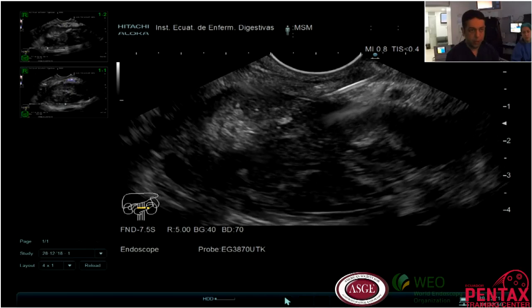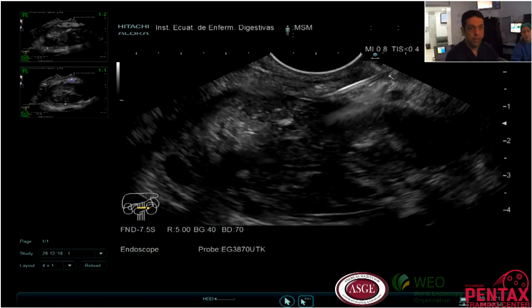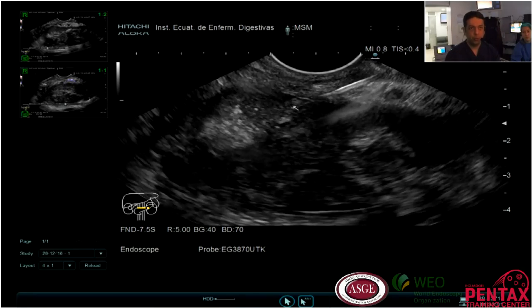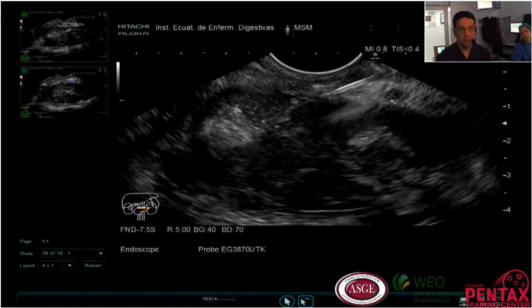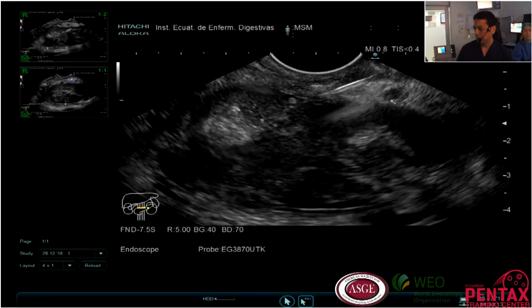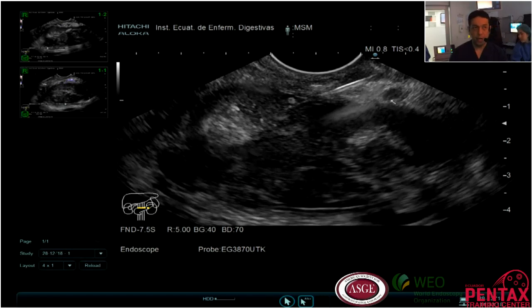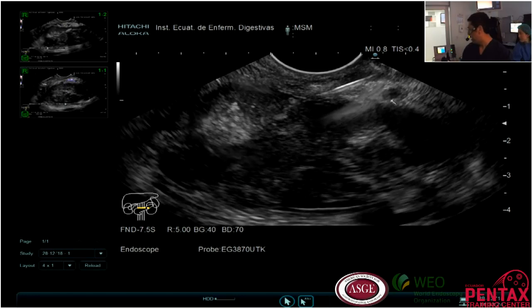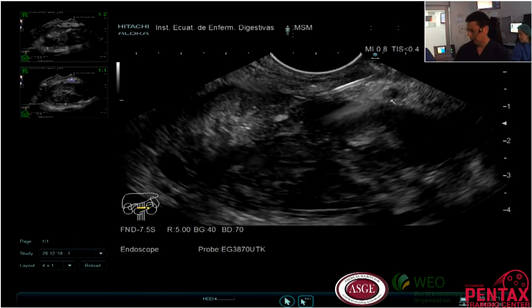So you can see very well here my guide wire, here is my gastroduodenal artery, and I will pass in this way. So I am going very sure to avoid the vessels and the branches of this vessel, because it could be catastrophic for this patient. So you will use the electrocautery. I use ERBE electrocautery, and we will use the AutoCut mode effect 5 with a maximum of 100 watts.